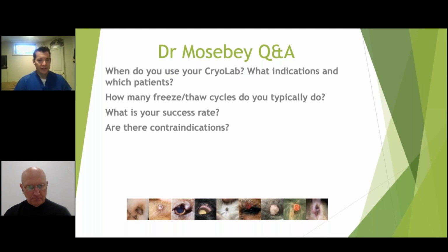I mean, most of the things we're freezing, meibomian glands and sebaceous adenomas, have very characteristic looks that mast cell tumors almost never look like. That would be the one contraindication, because we know mast cells can degranulate. If we're going through this freeze-thaw cycle, could we have an anaphylactic reaction from massive degranulation? And I think it's a theoretical thing.